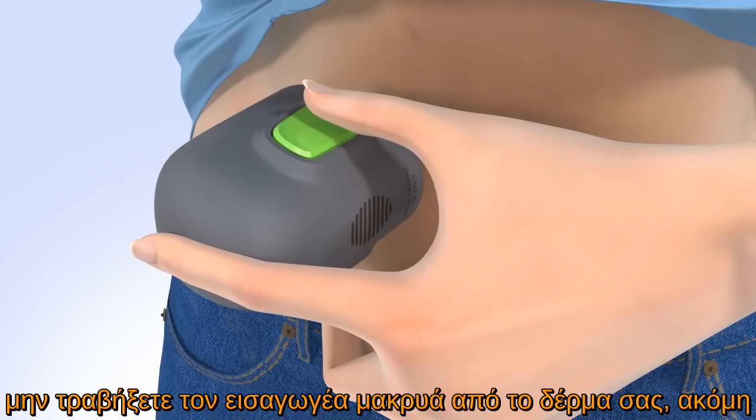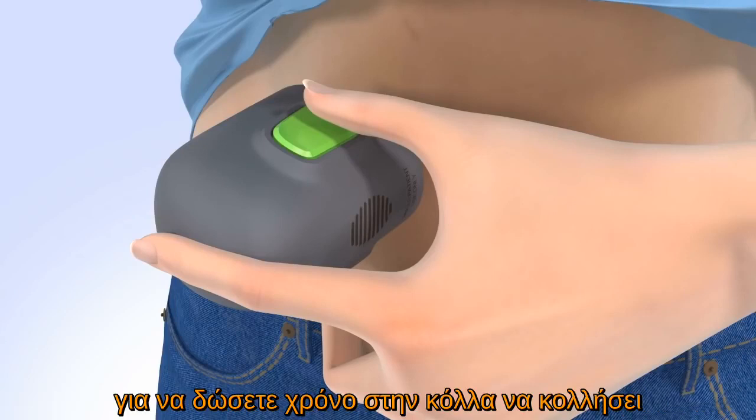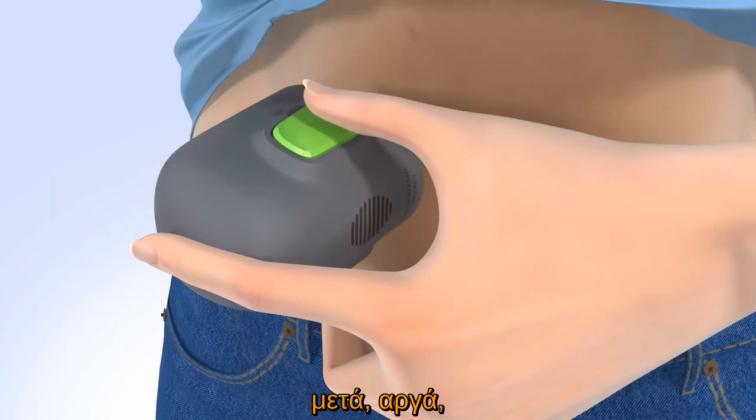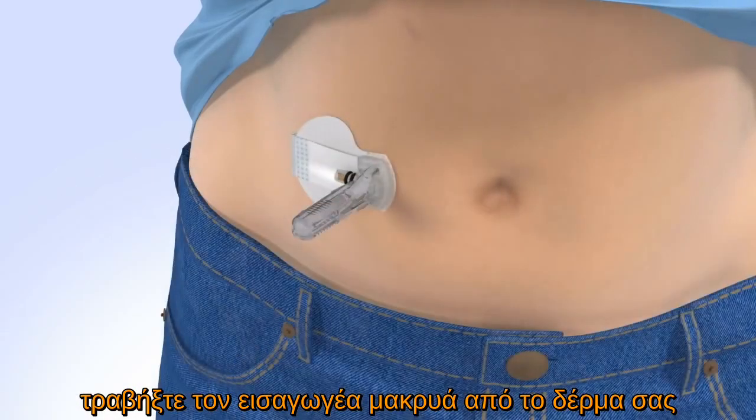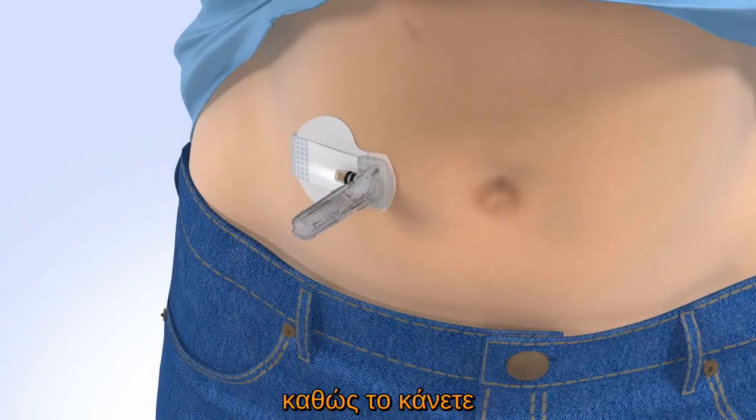Do not pull the Sertor away from your skin yet. Continue to hold the Sertor against your skin to allow time for the adhesive to stick. Then slowly pull the Sertor away from your skin, making sure you do not press the buttons while doing so.